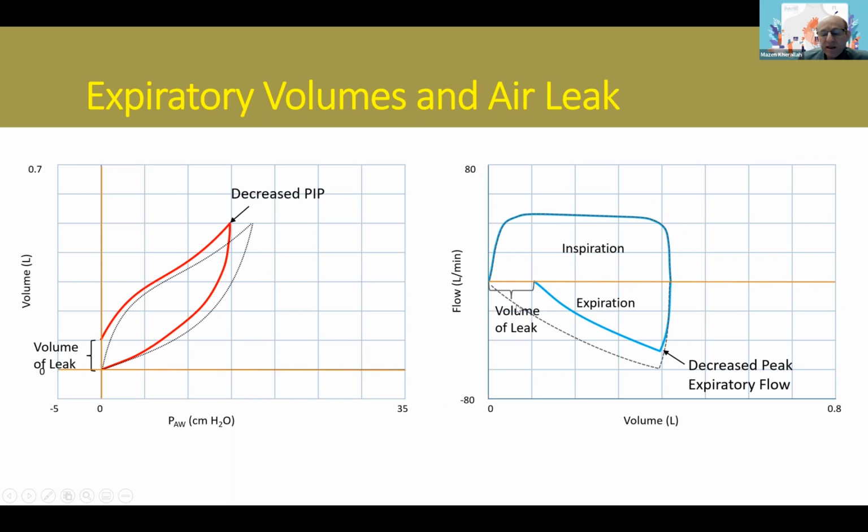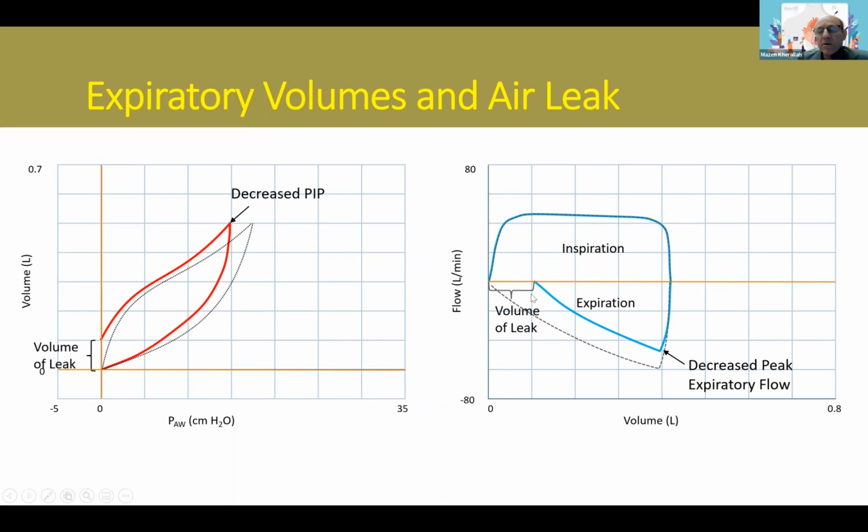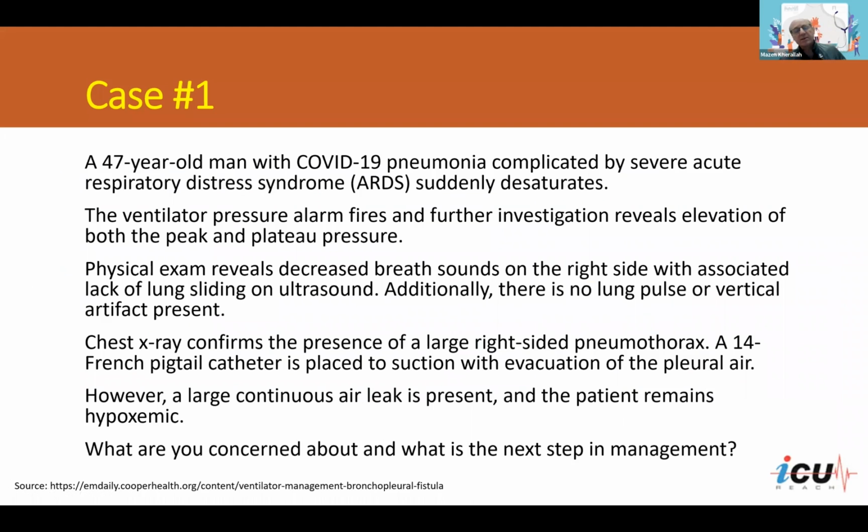So it is actually very easy to see how the volume of leak is represented or detected on the flow volume loop or on the volume pressure loop. So let's go through some cases. This is a 47-year-old patient with pneumonia and ARDS.